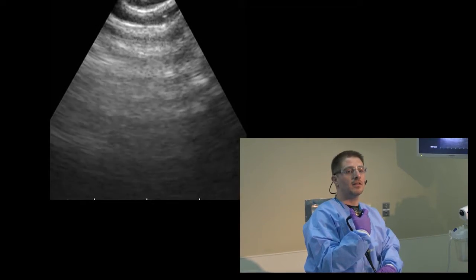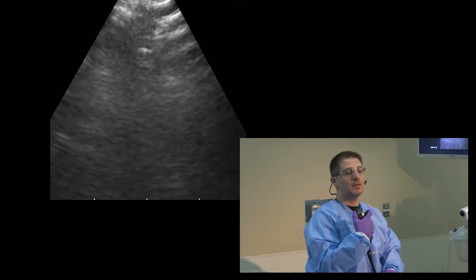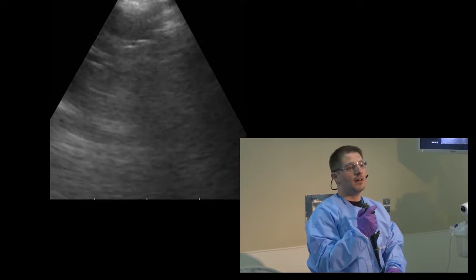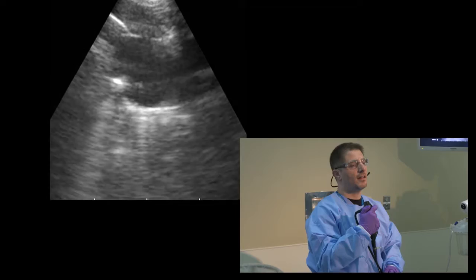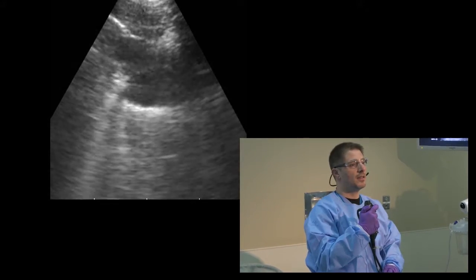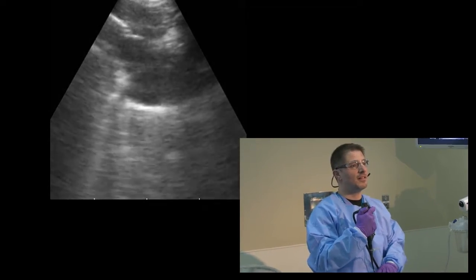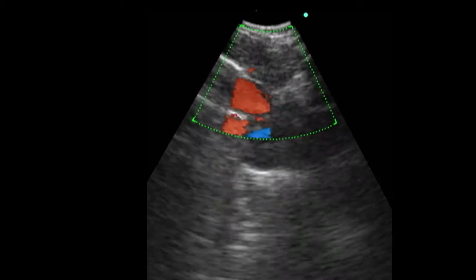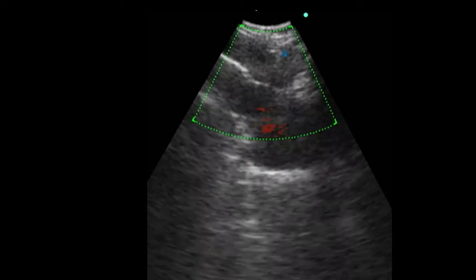11L is located in the carina between these two airways. You go under the carina and you try to find the lymph nodes, which you can identify here. If you have a doubt about it, you can put Doppler. Can you put color for me, please? Press color. And that's confirmed that what you see there is a lymph node. Color off, please.